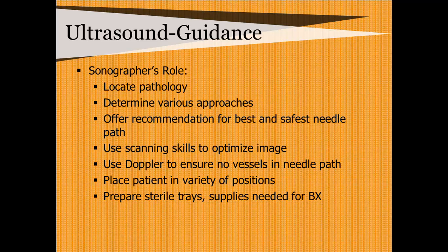You're going to use Doppler to ensure that no vessels are in the path of the needle, so you don't want to poke a vessel. That will cause a nice hematoma, and then you won't see anything. Or worse yet, you can cause pain to the patient. You can place the patient in various positions. That's your job too. And you're also going to be preparing the sterile trays and the supplies needed for the biopsy, making sure that all the forms are available, consent forms, lab forms, that type of thing.